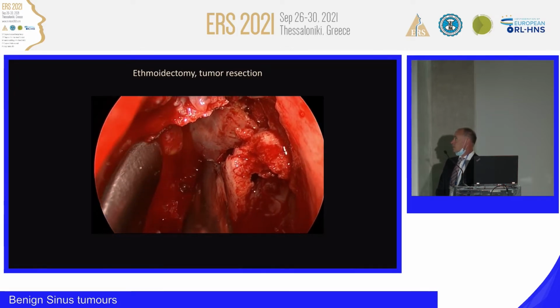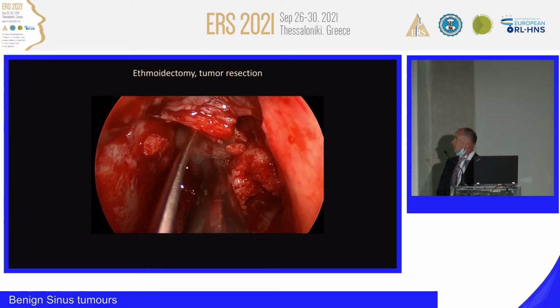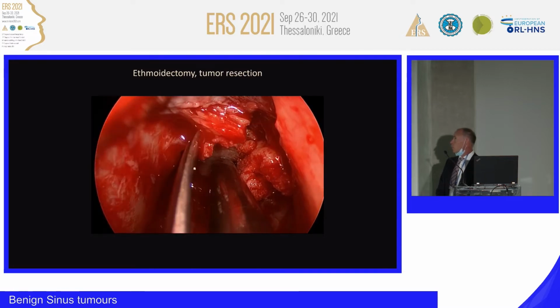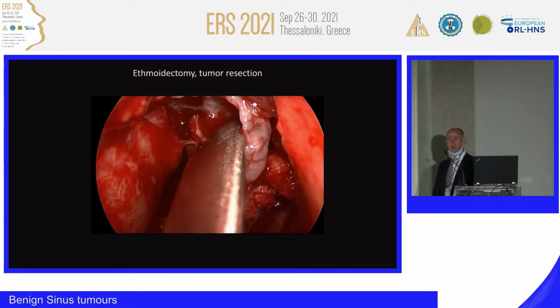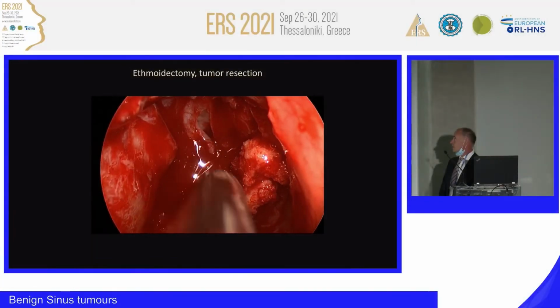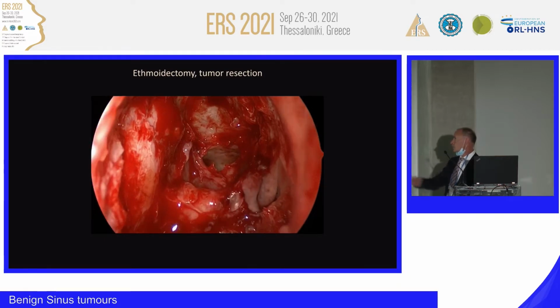There where the tip of the cottle dissector is, there the periorbit is open. So we had a little bit of orbital fat, but all in all, we managed just to take it out straightforward, not a difficult operation. You see that in these cases we work with the bimanual or four-hand technique. So we have the suction in the field and another instrument to do the dissection. Easy, straightforward, did not take very long.